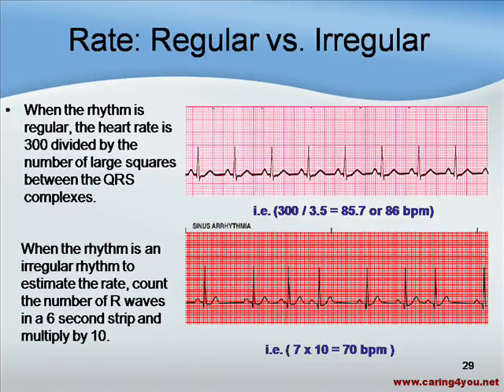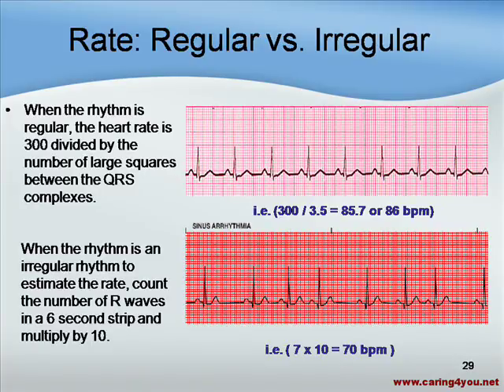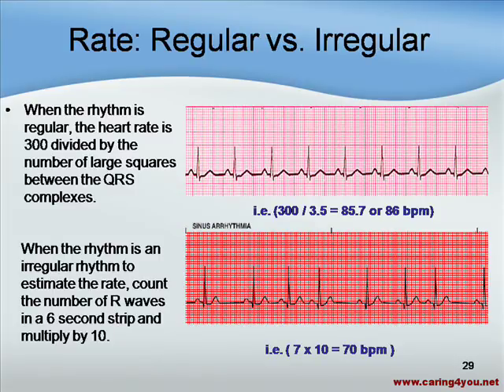When the rhythm is irregular, to estimate the rate you count the number of R waves in a 6-second strip and multiply by 10. In this strip we have 7 R complexes, so 7 times 10 equals 70 beats per minute. Note that we actually have 8 R's, but that last R on the end of the strip is outside of the 6-second boundary. You only count what is within the notch-to-notch 6-second interval.